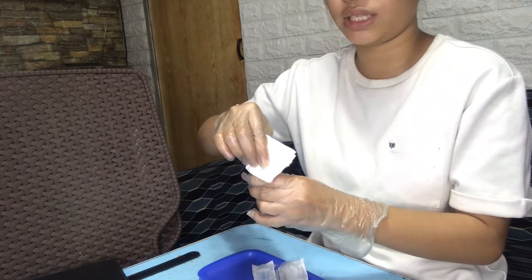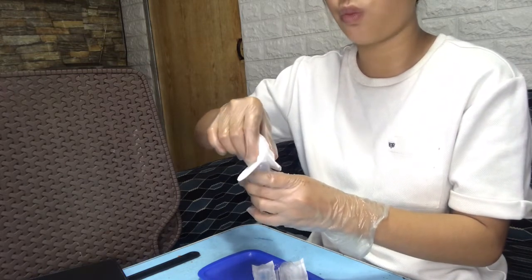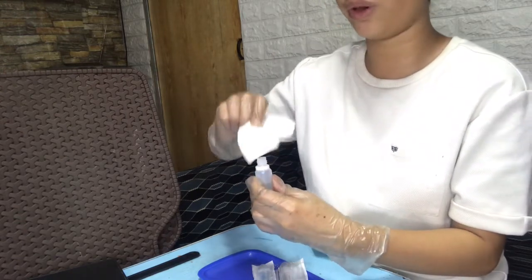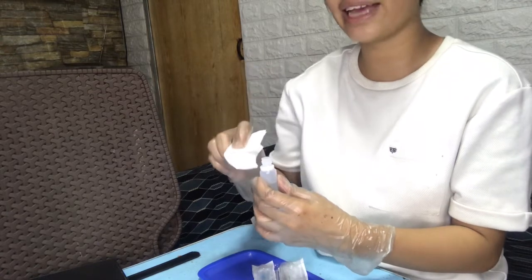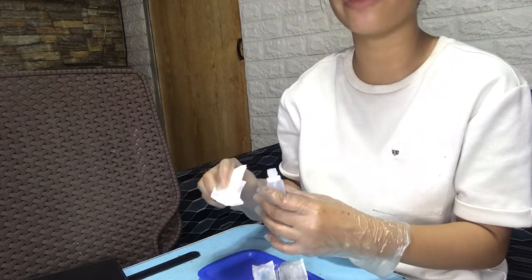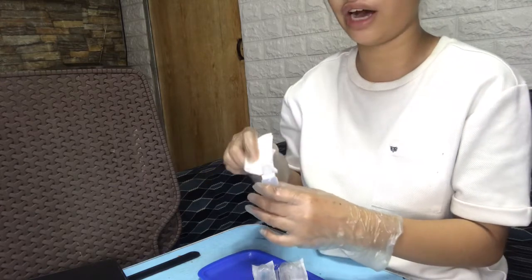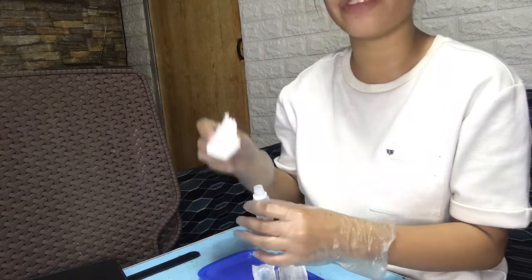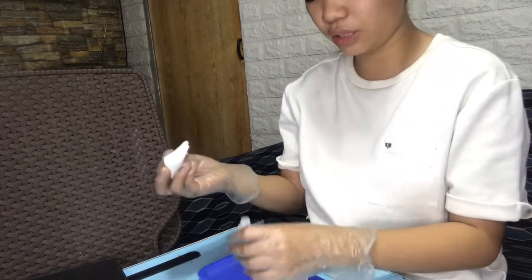Let's just break this one towards you. So we already broke it. Next, place the antiseptic wipe packet over the top of the ampule before breaking off the top. Dispose of the top of the ampule in the sharps container.